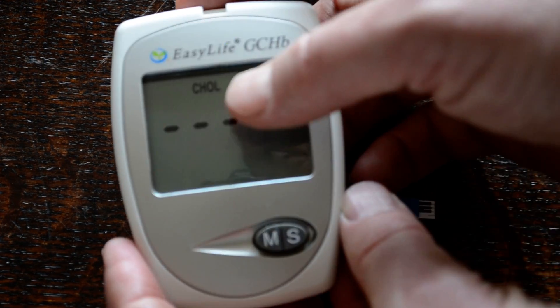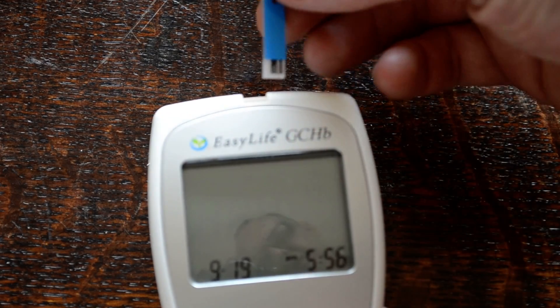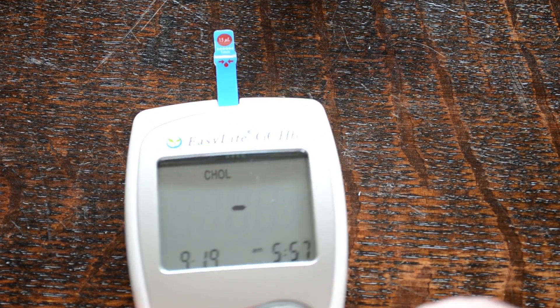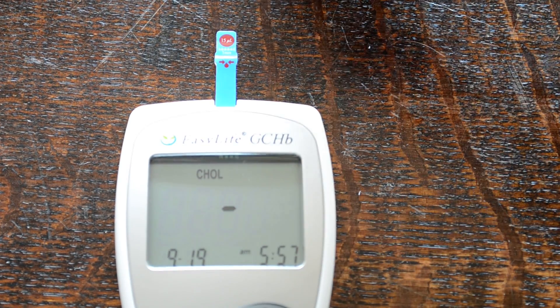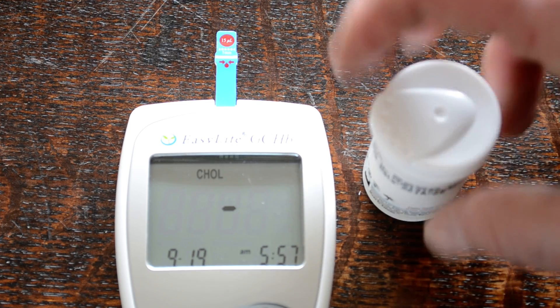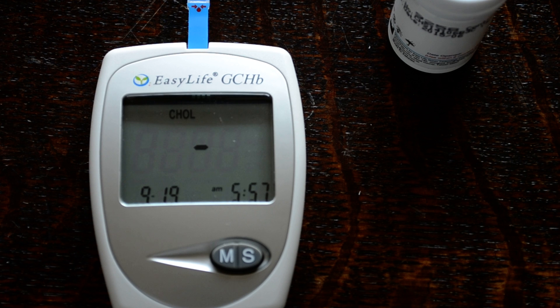When we power up it shows you cholesterol, and when we put the test strip in, the first thing you should see is that code number 9258. As soon as that shows, you know you've got the correct code chip for the batch of test strips. The code chip basically calibrates the meter for that batch of test strips to ensure accurate results. Each time you buy new test strips, the code chip must match that batch.